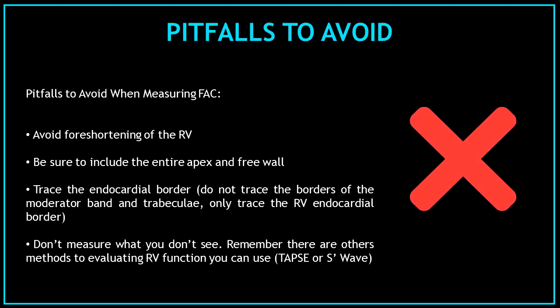Pitfalls to avoid when measuring fractional area change: Avoid foreshortening of the right ventricle. Be sure to include the entire apex and free wall. Trace the endocardial border — do not trace the borders of the moderator band and trabeculations. Only trace the right ventricular endocardial border. And most importantly, don't measure what you don't see. Remember, there are other methods to evaluate right ventricular function you can use, like TAPSE or S-wave.